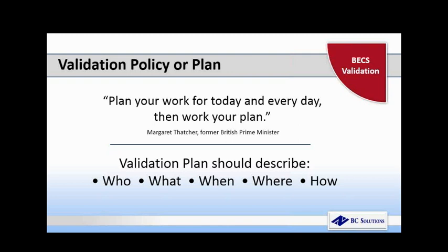And once you have this plan outlined, then you would follow the plan whenever a need for a validation arises. And please note that the items that we're going to talk about today and the plan that you lay out for your validation would need to be observable in the facility's final validation documentation, whether you perform the validation or whether you contract it out.